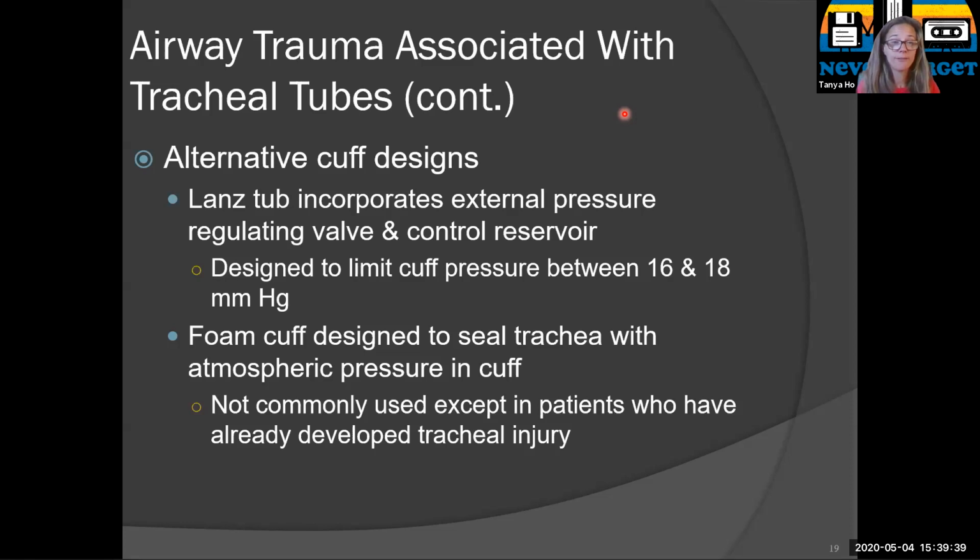So the foam cuff is something that I've never seen on an endotracheal tube. That's not to say that they don't exist. Perhaps there could be some on some fancy endotracheal tubes that they use for different types of surgery or radiation therapy for cancer patients or something like that. But most cuffs that I've seen on standard endotracheal tubes are just air cuffs. You can have some that you can fill with water, okay? But just FYI.